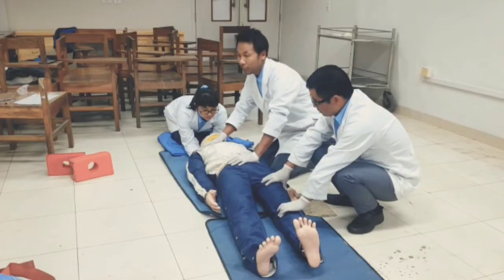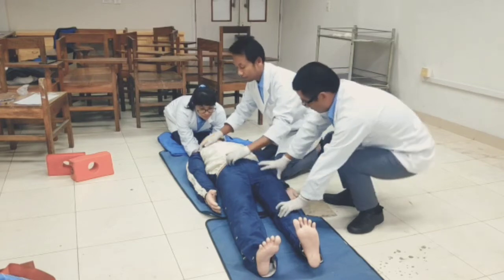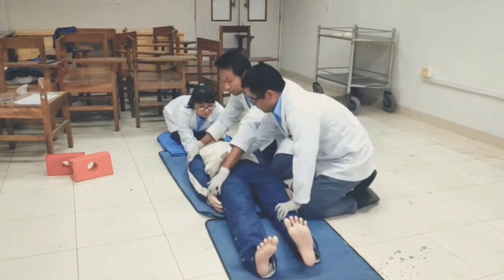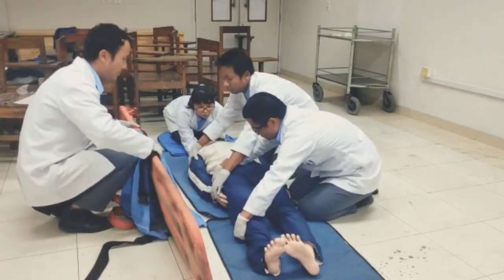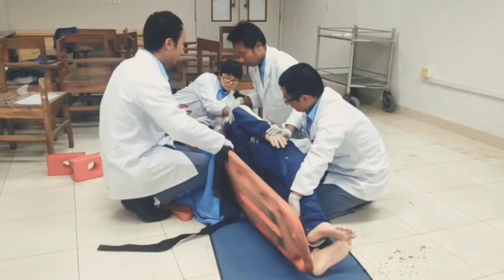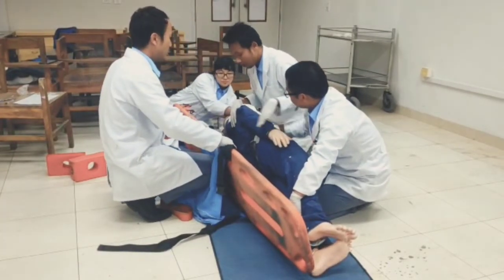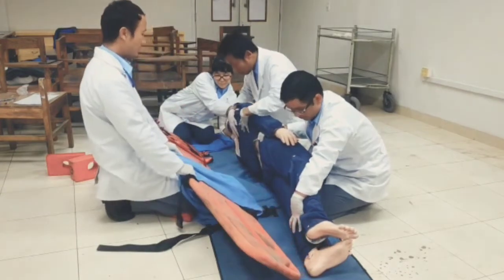To immobilize the patient, we have to apply a spinal board. To apply a spinal board, we have to do a log roll. One, two, three. Then we have to do a posterior examination using DCAP-BTLS.